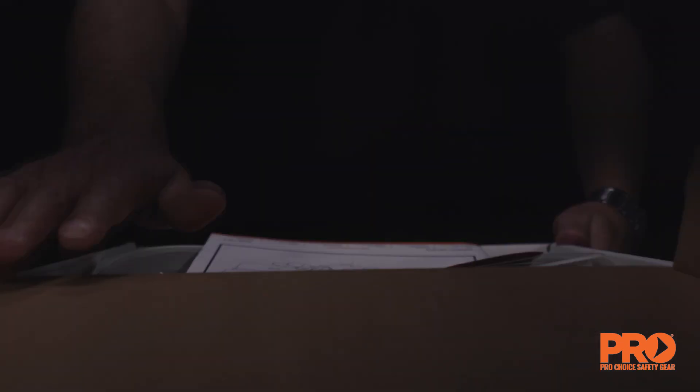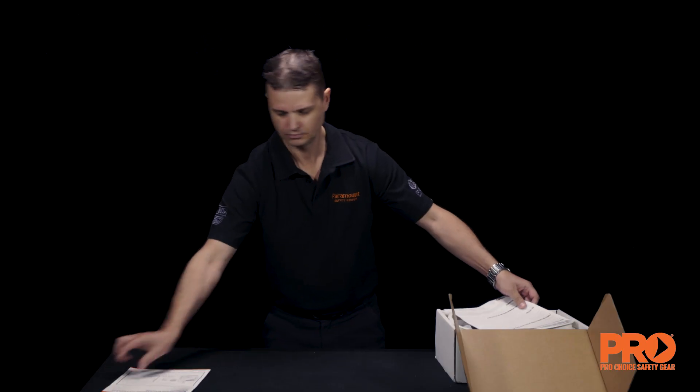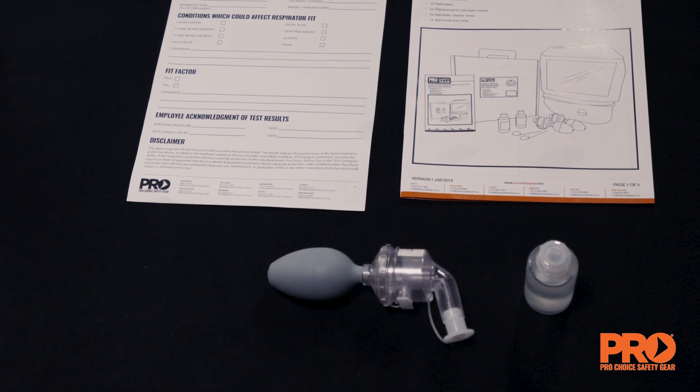Open the box and remove contents. Enclosed is an instruction manual plus a fit test record sheet. Ensure all the contents are included.